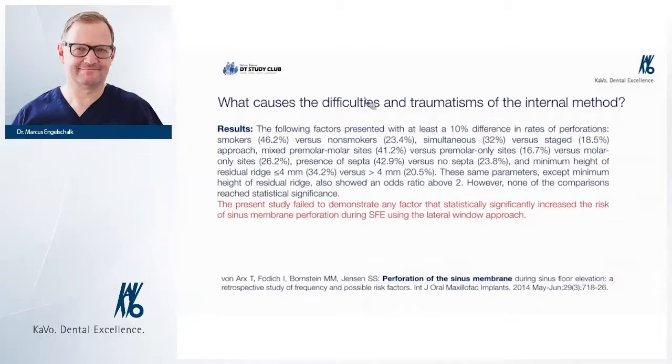Your augmentation material in the prepared sinus shows you the amount of filling material you need and shows you if there is a hole or not. But then it's too late, I would say, because you're creating infections. So these colored pictures show you it's a very small entrance and it's very easy to perform from this point.